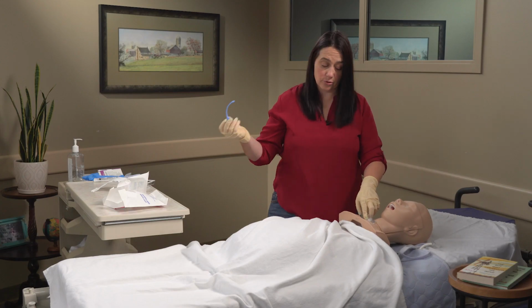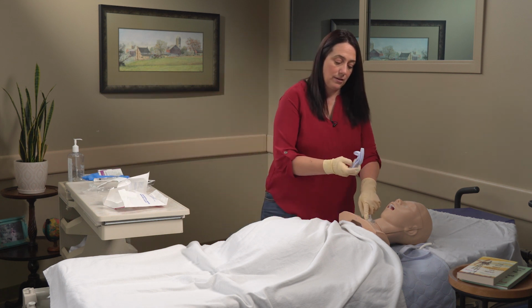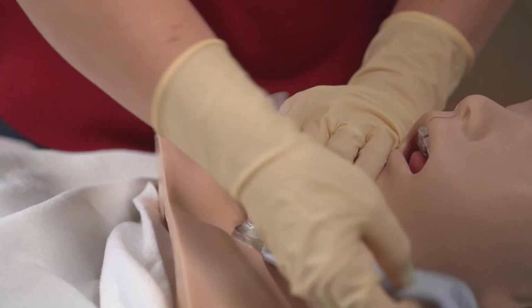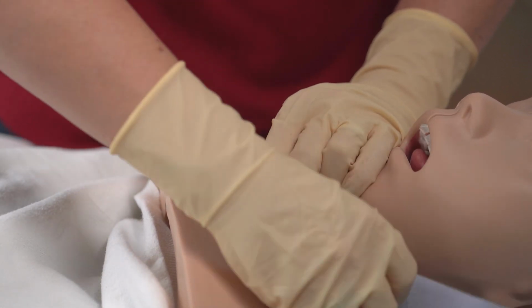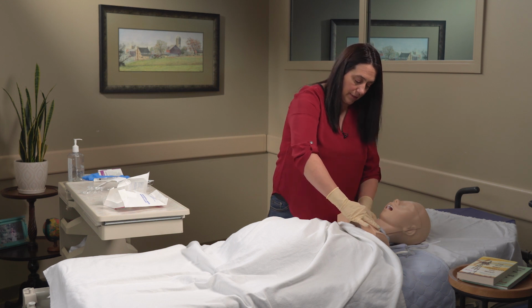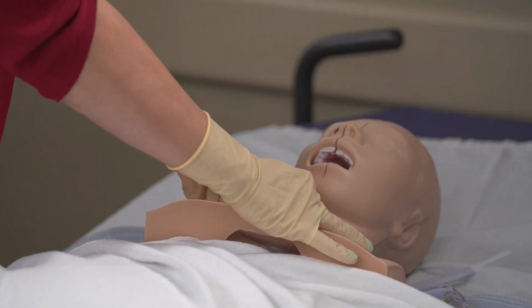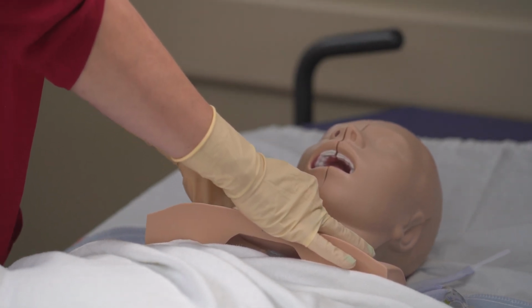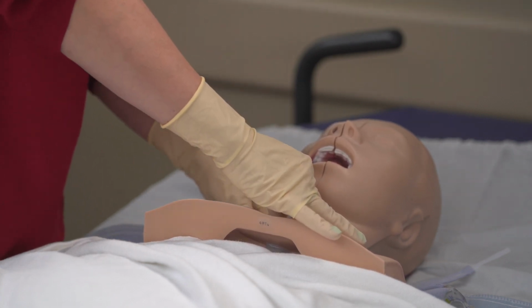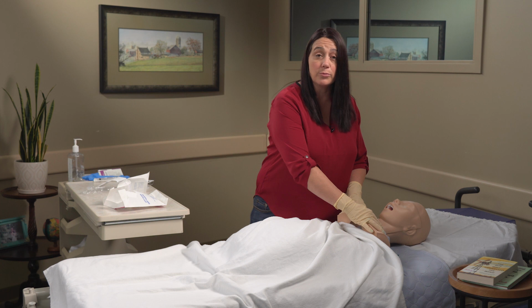I immediately take out the tube obturator, and now I can go ahead and place the new trach tie on my patient. I'm going to keep one finger on the trach while I'm doing this so that I don't have any issues with it moving. So I've got the trach tie connected on one side. I'm going to come to the other side. I'm going to go ahead and connect it here, doing my best to keep the person comfortable and minimize any movement to the tracheostomy while I'm in this process. So I've got both sides down securely now. The trach has been replaced successfully.